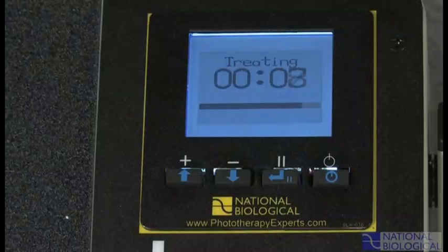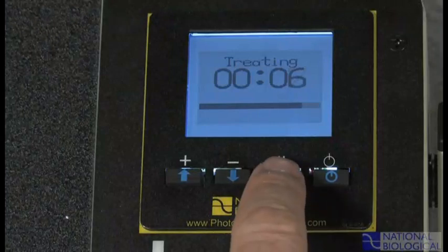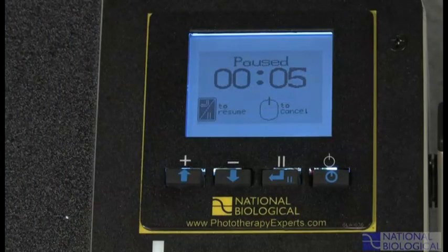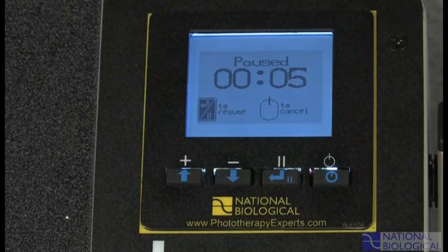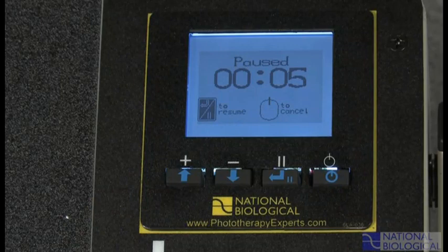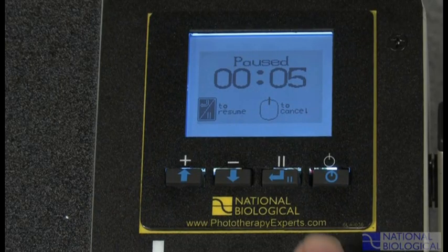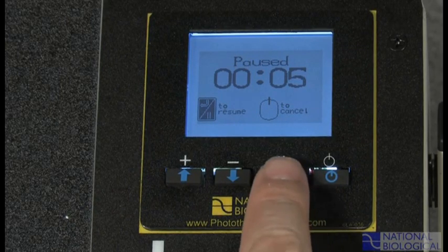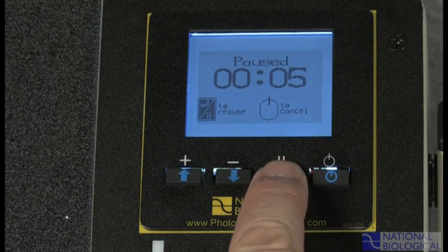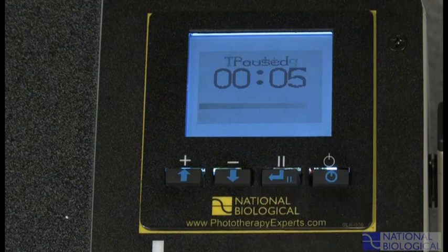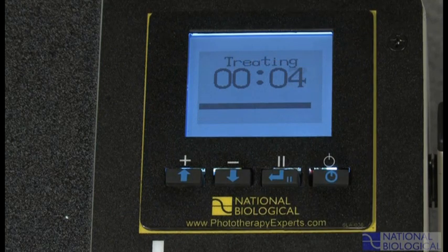There are two ways you can interrupt a treatment in progress. Press pause — the countdown will halt, the lamps will shut off, and the pause screen will appear. To resume, press pause again. The lamps will relight, the treating screen will reappear, and the countdown will resume.